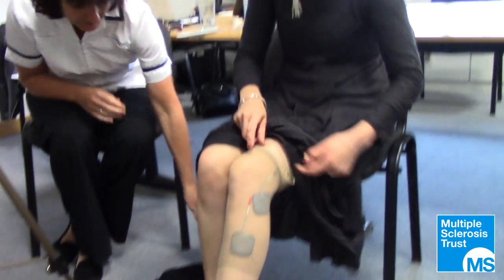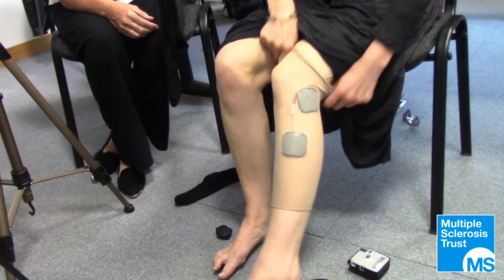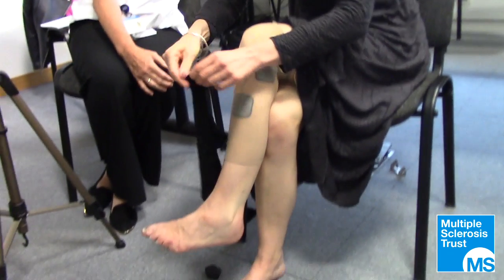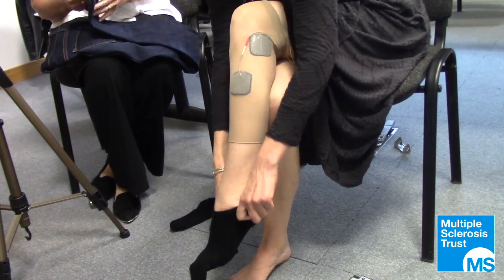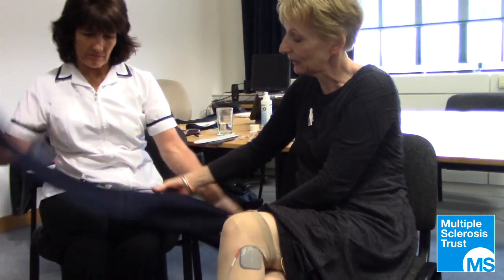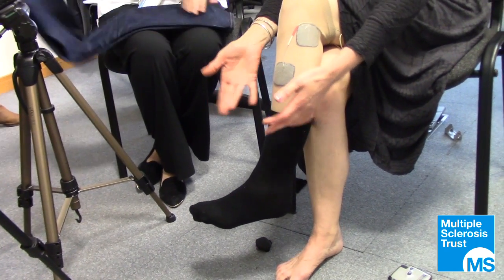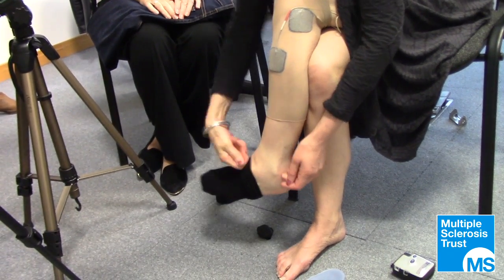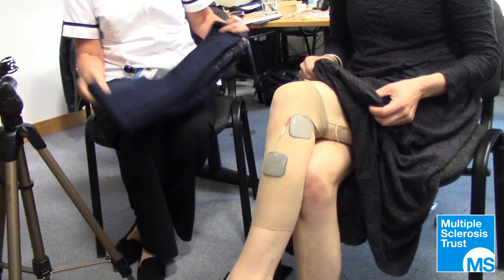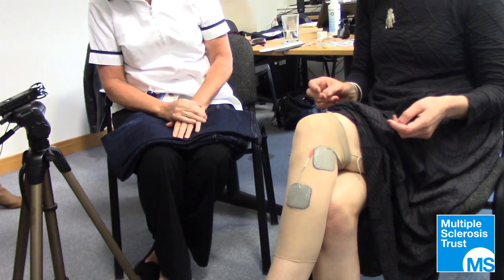If you want to wear skinny jeans, what works brilliantly is to still have the electrodes covered but move your pop sock down quite a bit. Make sure you're not cutting off your blood supply. Get your ordinary sock and get it so it covers the pop sock by a good inch — then you really can get into skinny jeans and it works. The reason for having the tubigrip or sock under skinny jeans is that these are sticky pads that can stick to the jeans and move; it's important they stay on the leg in the correct position to stimulate the nerve.